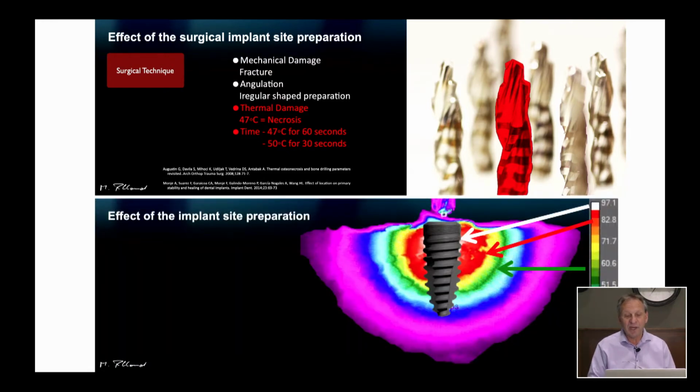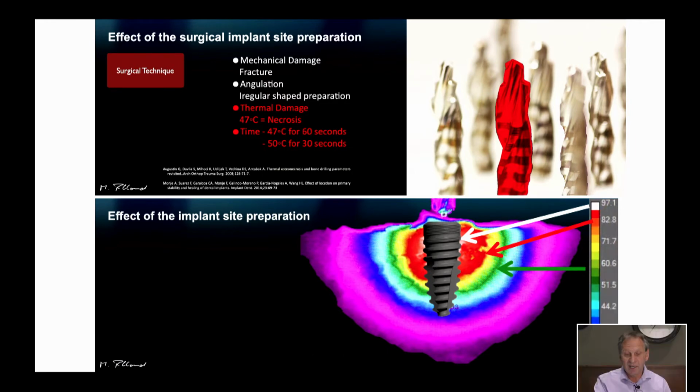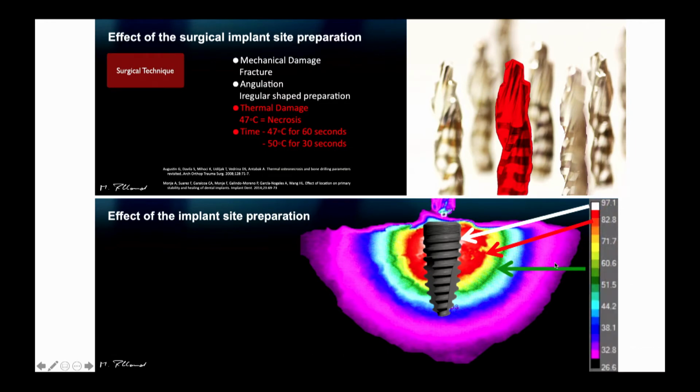I used to think if you had a pilot drill that wasn't very sharp, no big deal. The studies out there show that if you have a pilot drill and you're in there for very long at all, you can generate some tremendous heat, and the heat will spread out about 20 millimeters from the initial pilot drill hole. That was news to me, but pretty well researched. They're actually showing a lot of implant cases that have endo on adjacent teeth because they burn the bone around the adjacent tooth.